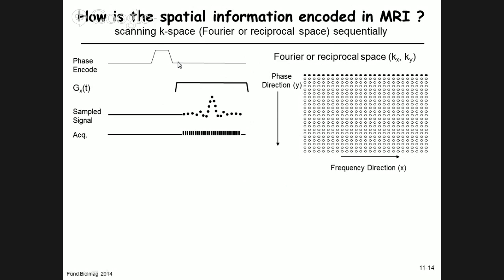Okay. Now I'll do the next experiment after TR seconds. I'll turn on this phase encode gradient. The frequency gradient is the same. This will now fill in this line of data points in the matrix, in the computer, or in k-space. Remember, there's always a computer behind it, an analog digital converter. The data is digitized, and row by row is now filled into this two-dimensional matrix.